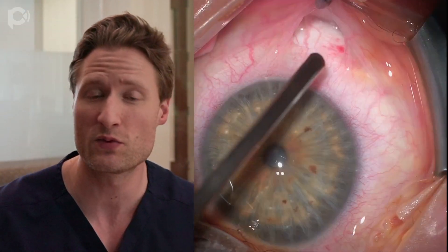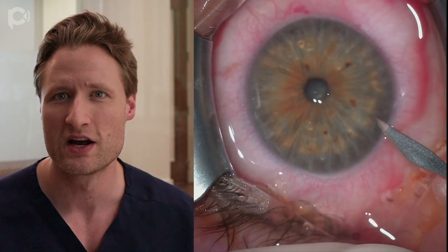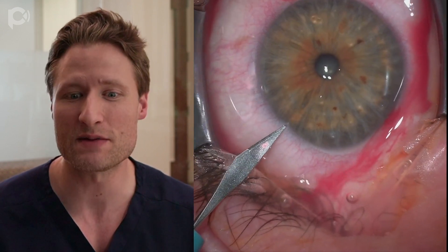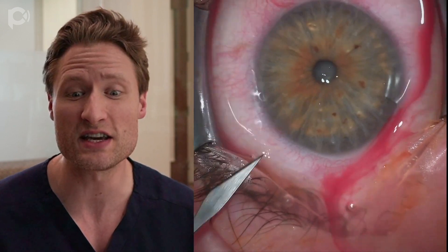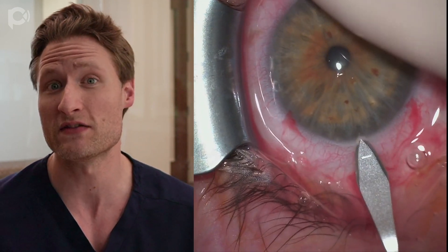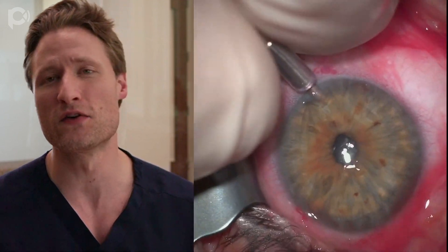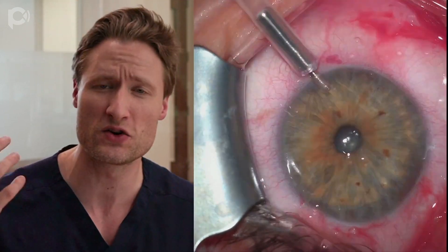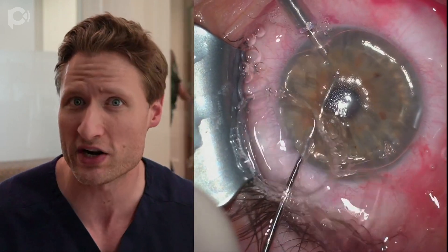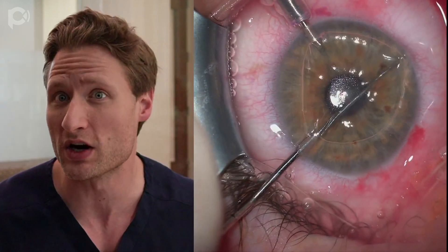This is a phacic DMEC that we did in our office last week, and I just want to review a few instructive highlights. The anesthesia is topical, supplemented with one cc of subtenons lidocaine or bupivacaine or both. I like to use a one cc volume because if you use a greater amount, you're going to increase your posterior pressure, which makes the anterior chamber even more unstable.